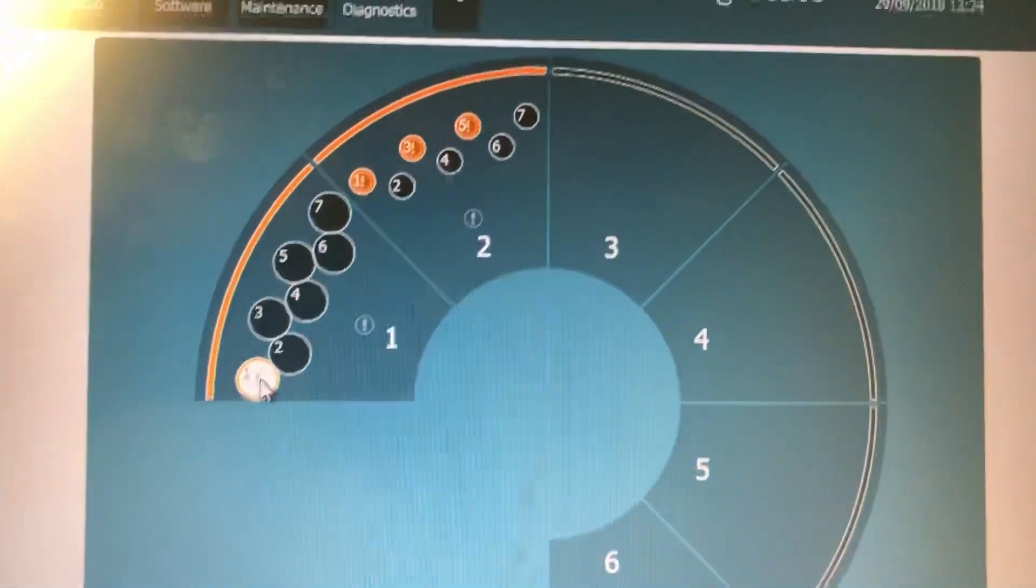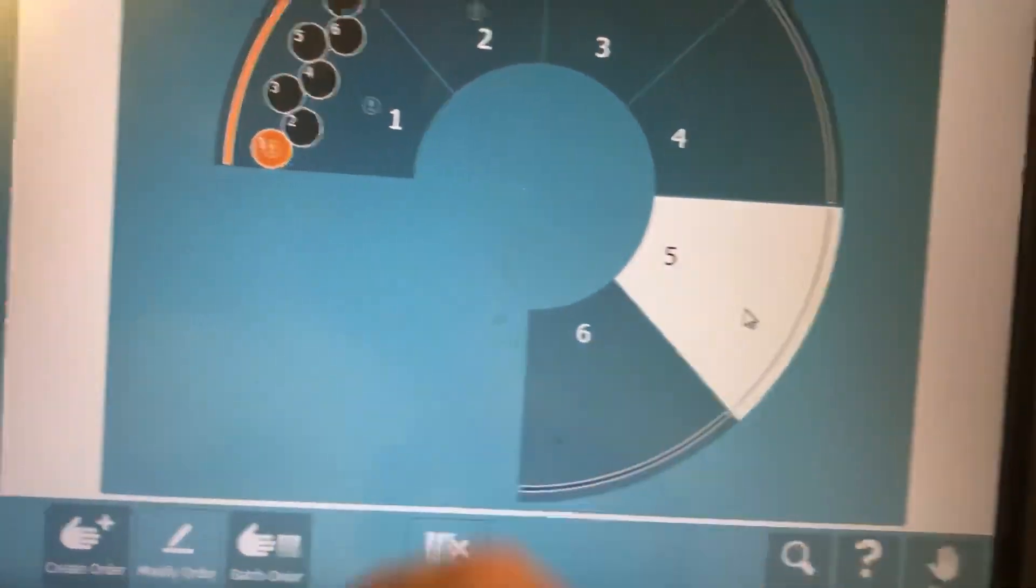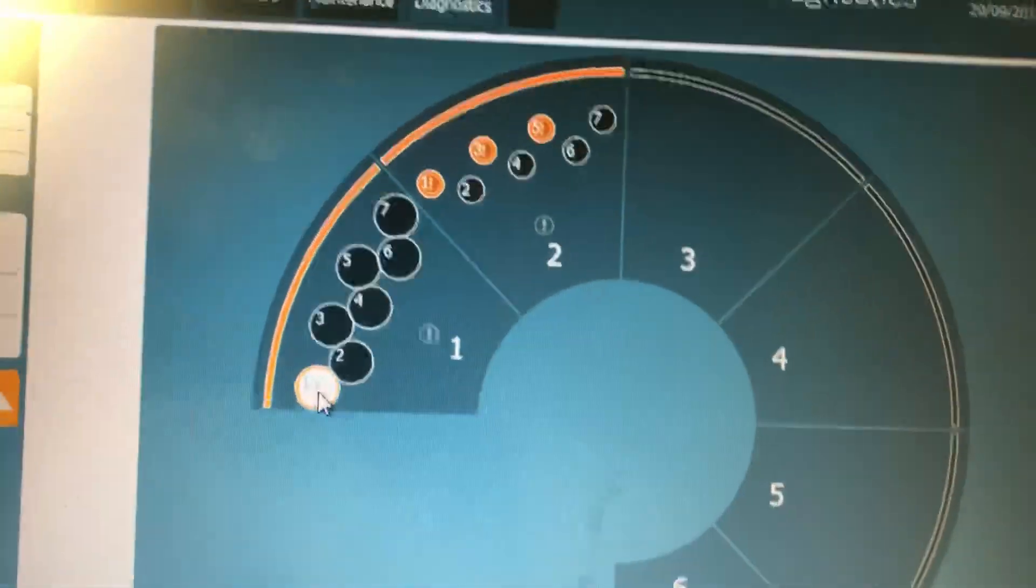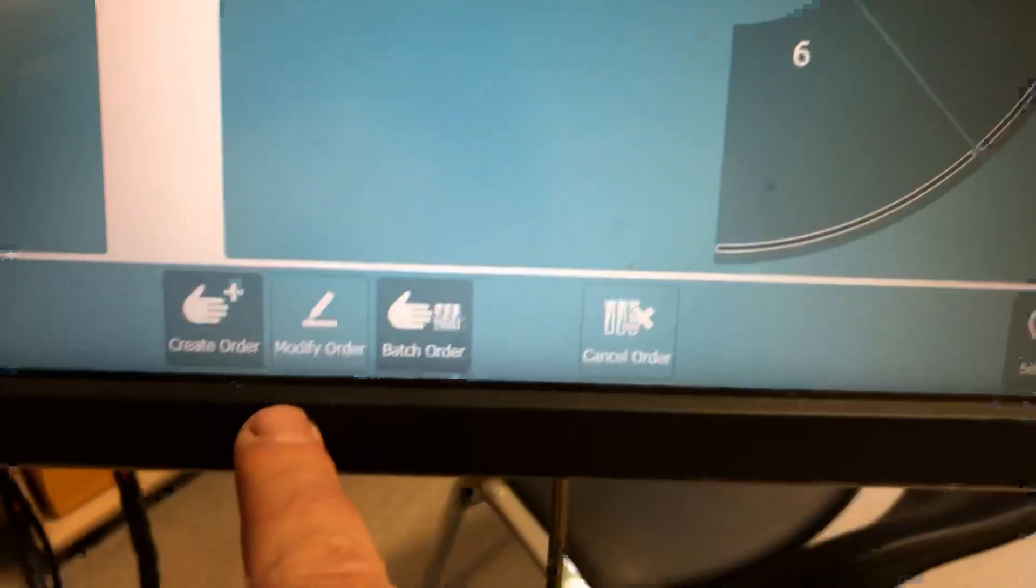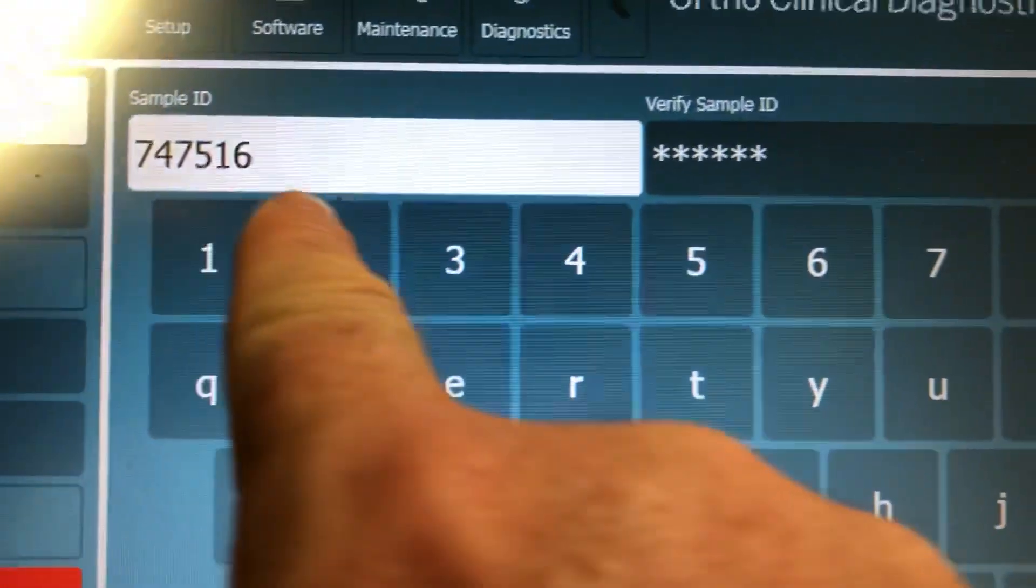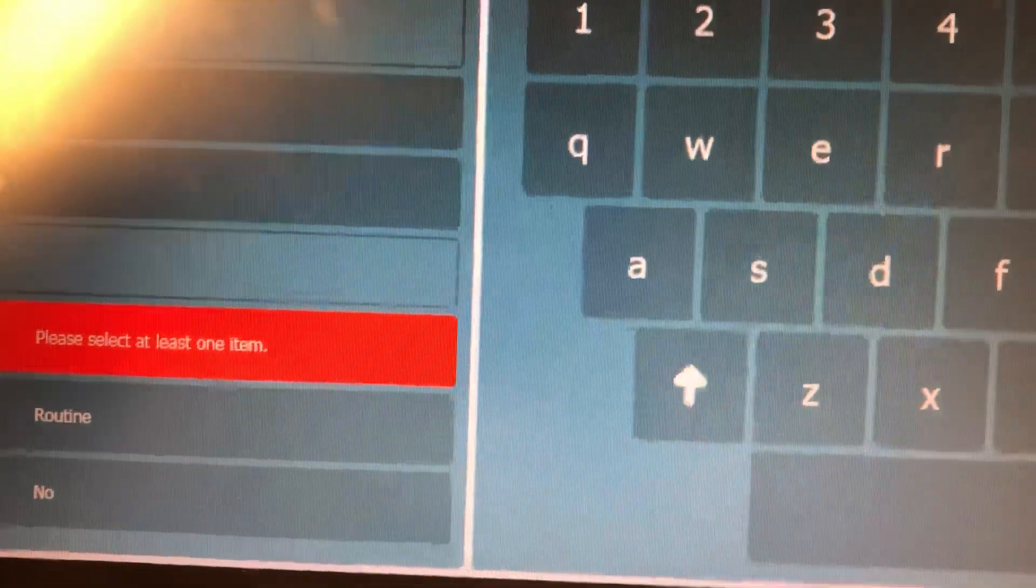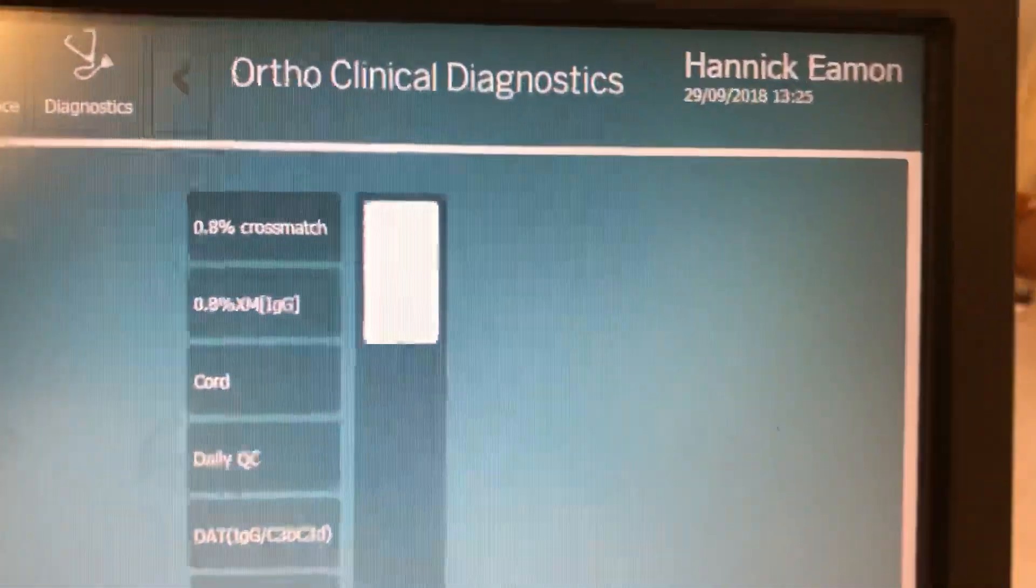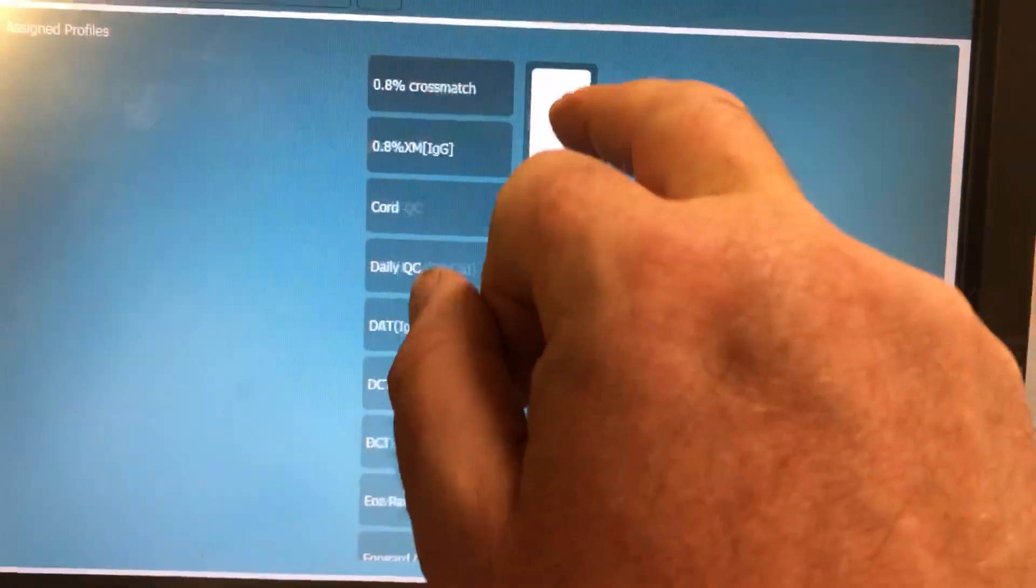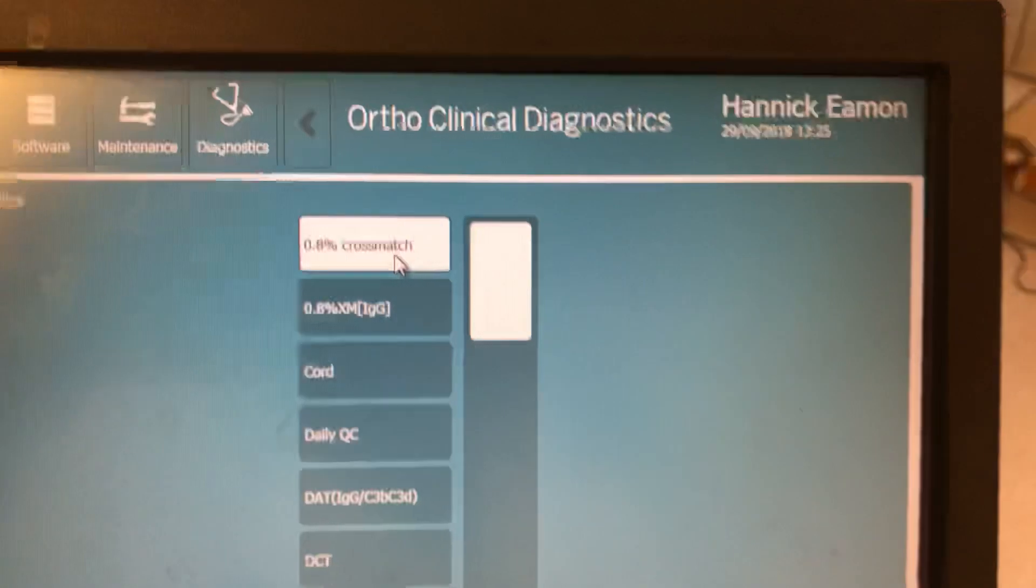So what we have to do is we have to manually request the test. Now what we do is we highlight the sample that we want to do the cross match on, we go to create order, and you'll see that the number automatically fills here. And now we want to assign the test. When I click that I have my full list of profiles of all the tests that I can possibly run on the vision. And at the very very top I have the 0.8% cross match.